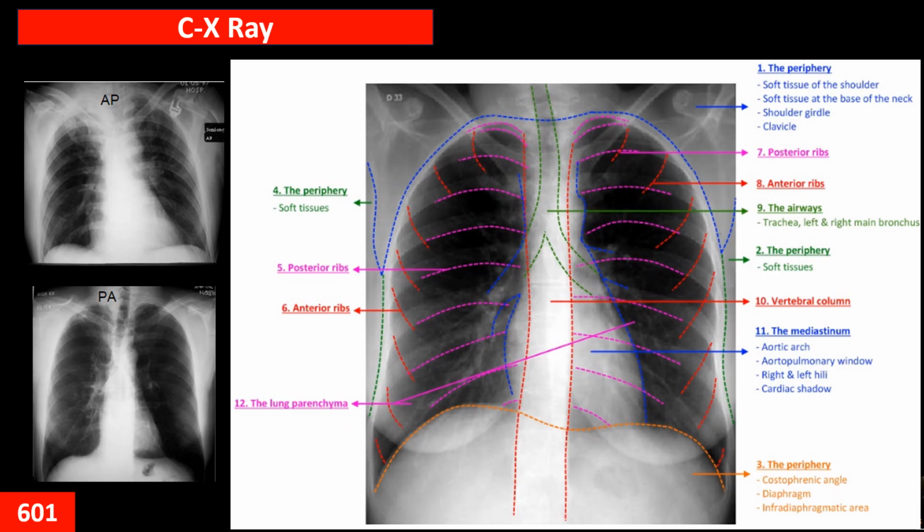As I mentioned, the ultrasound cannot pass through the lung. So in those situations that we have localized pathology in the lung, we can make our study more attentive and focused. For that reason, in those patients who have some extra modality images, especially in hospital settings like the chest X-ray or CT scan, it can help us go for targeted ultrasound of the lung, especially when we see any pathology. For that reason, I will explain shortly about the chest X-ray and CT scan. Then we go for the ultrasound of the lung.